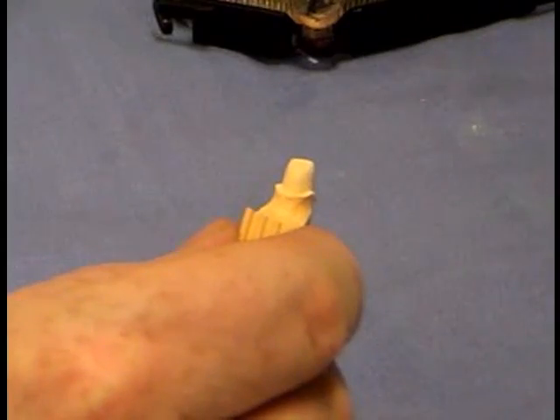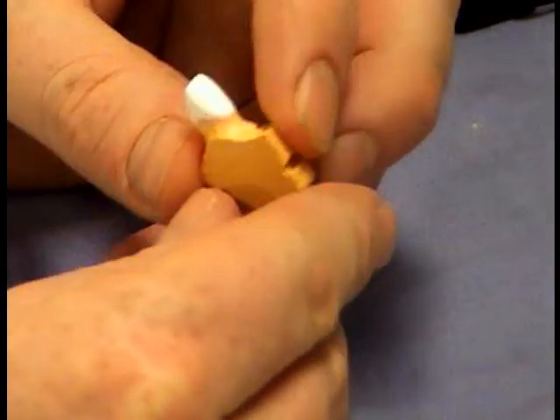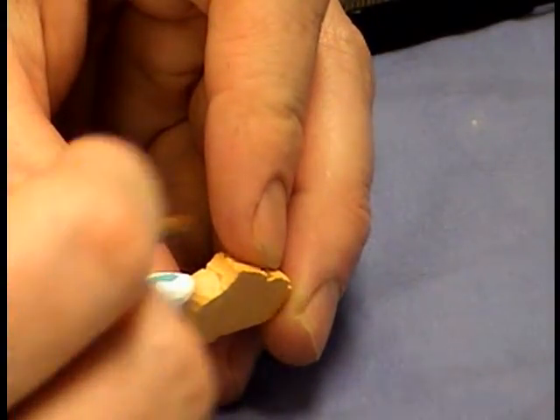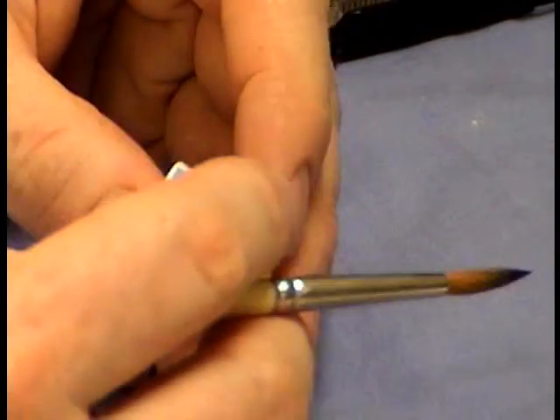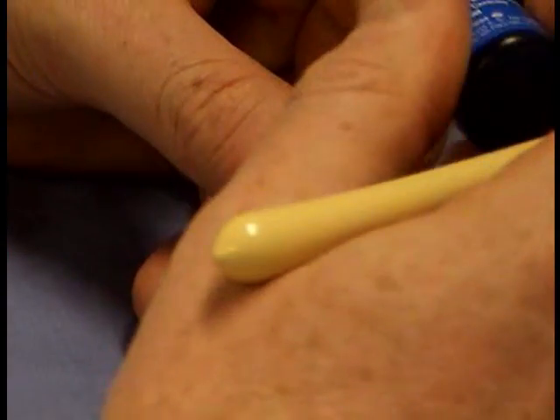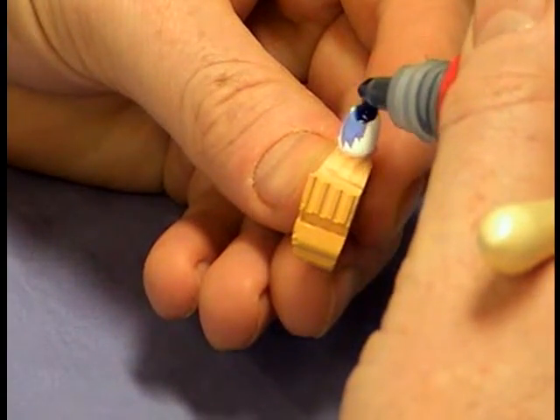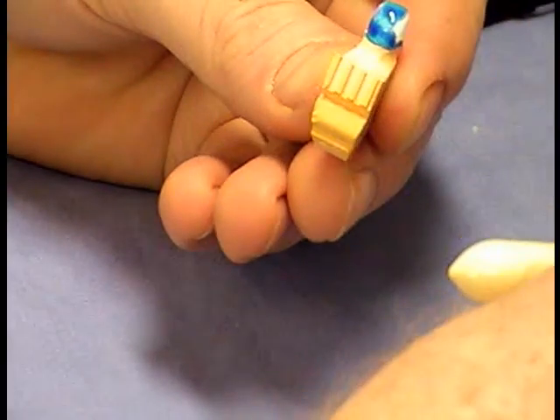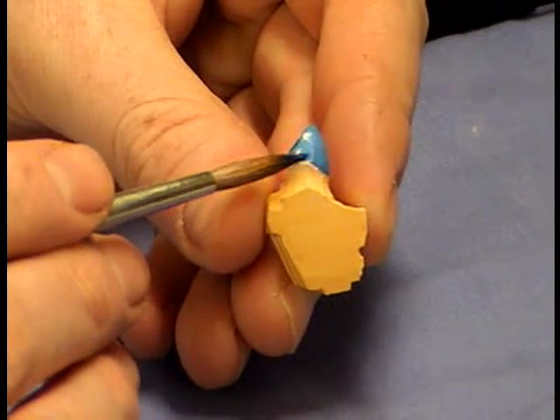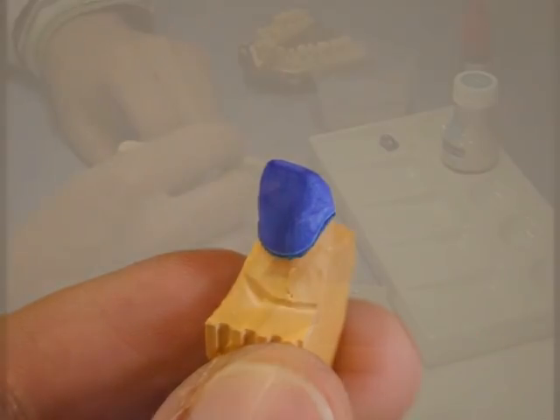Once it's done it goes back onto the die. The next step is to put some blue-coloured dye onto the coping to check for any cracks caused by the milling process. If there were cracks you'd see them as a dark line on the surface. With this material, because the block has been manufactured under industrial conditions and high pressure, the chances of a crack are quite thin — much lower than if you'd made an alumina or zirconia coping by the slip casting technique. In this case it looks really good and even.